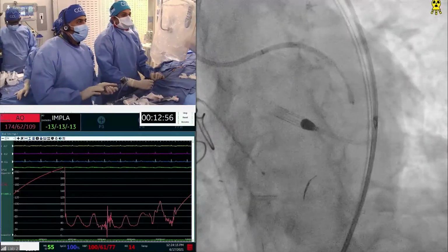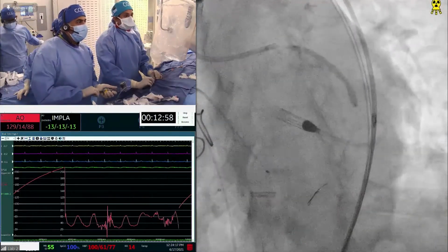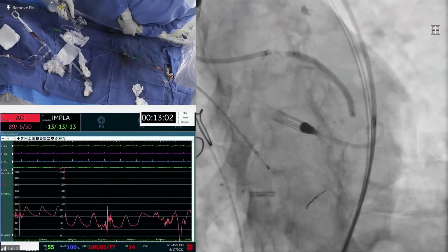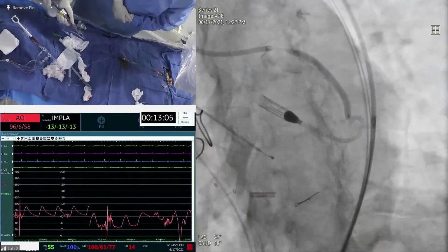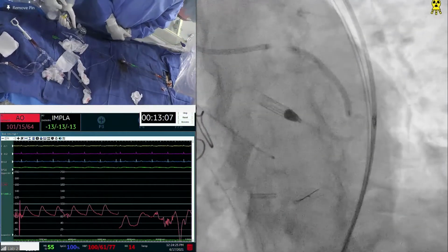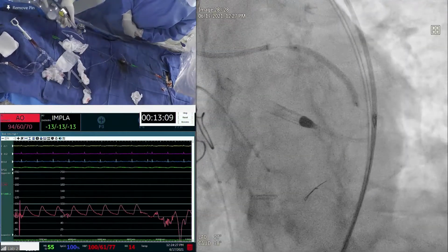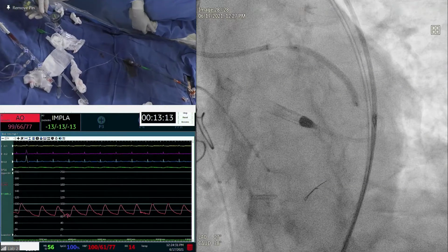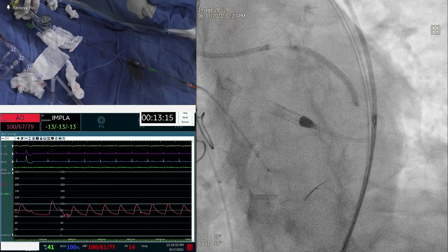So, all kinds of tools. Now your guide is very deep. You just brought it back. No, I pulled back. Yep. What size is this? If you need a short stent, this is a 30/38. If you need a 3.25 or 3.5, we will put a high pressure 3.5 into the left main and then we'll post dilate the left main.